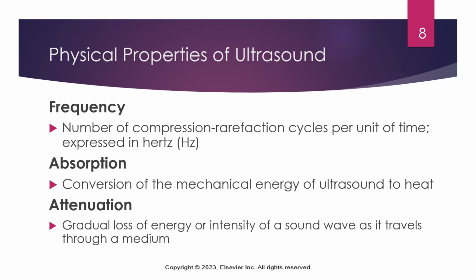That just means that we need to set the parameters correctly, increase the intensity, and then make sure that our patient isn't experiencing any of those adverse reactions that we don't want to see, like burning of the periosteum of the bone, or increasing the heat too intensely, too quickly in the collagen structures like tendons or ligaments.